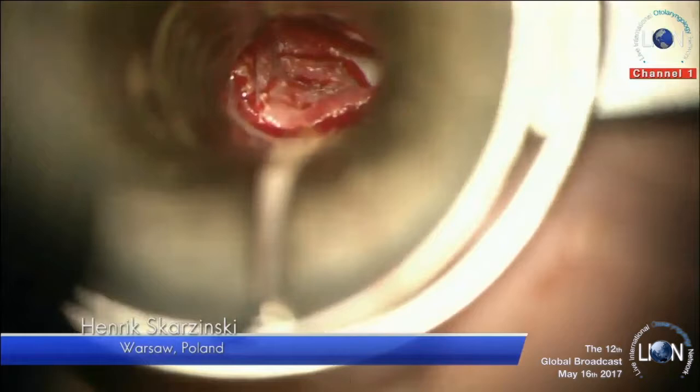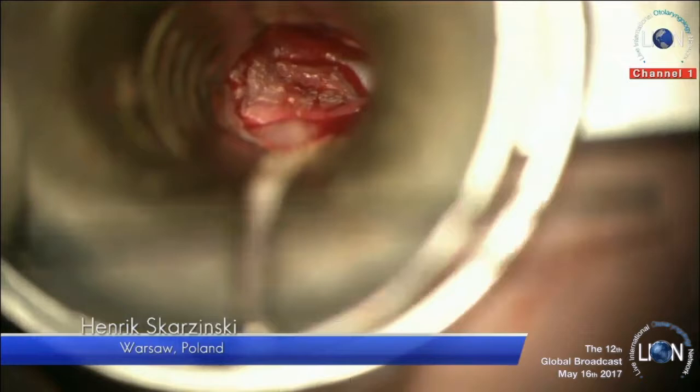What was the professor just putting in there? It's tissue glue — fibrin glue for the tympanomeatal flap. And now we place the foil, which is taken out around seven days after surgery. We prefer to use foil in color, like blue or red, but it's five to ten times more expensive than regular foil. And we have around 50 surgeries per day, so it's a significant cost.